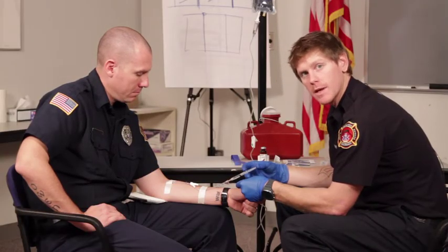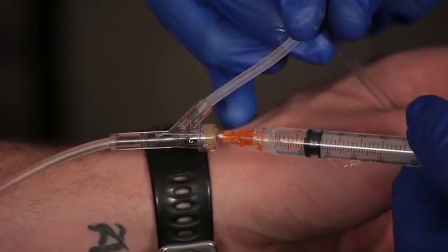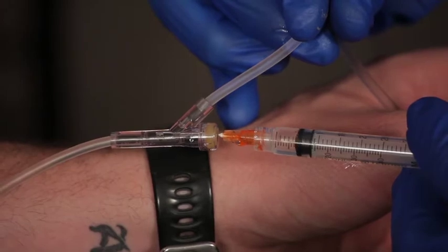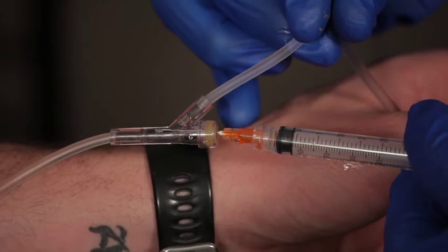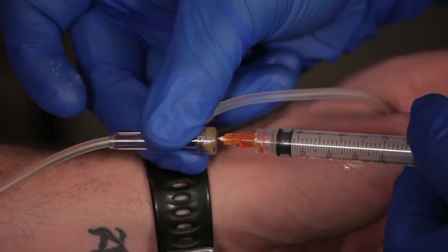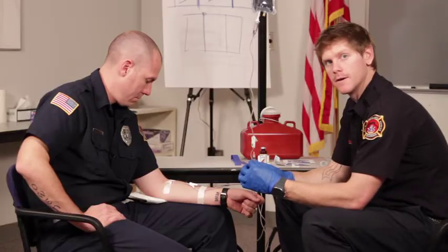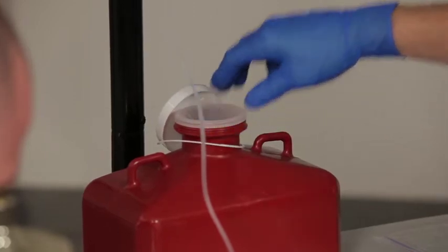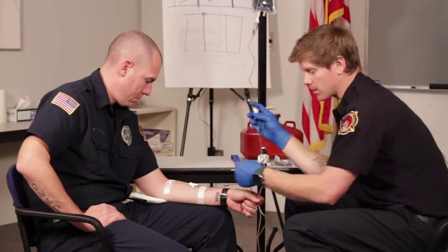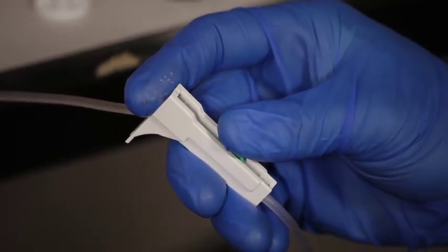When we push our medication we'll make sure we push it at the right rate and give them the right dose. When we withdraw the needle we want to dispose of it into the appropriate sharps container. We want to make sure we get a good flush of medication and set the appropriate drip rate.